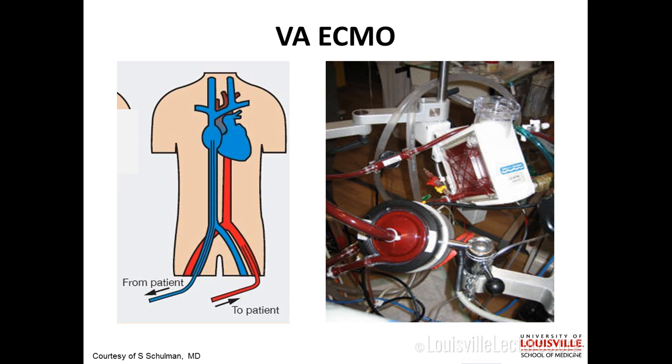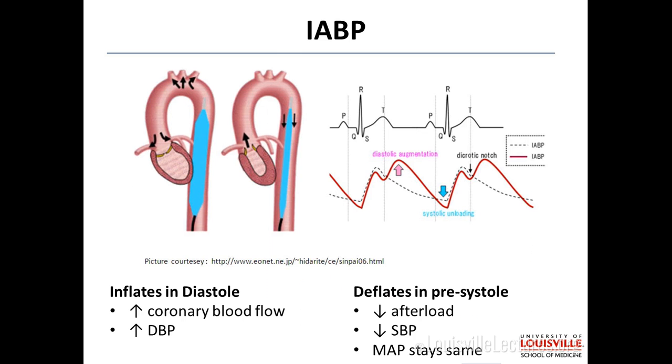Now, sometimes a balloon pump will get put in the cath lab when the patient is crashing and burning and the blood pressure is low and we don't really know what's going on. Sometimes a balloon pump will get inserted in order to help go through the procedure. And then we have to deal with it in the CCU afterwards. So there are times when it gets inserted because we don't exactly know what's going on and we need some quick support, and we'll put the balloon pump in and then sort through the pieces later.